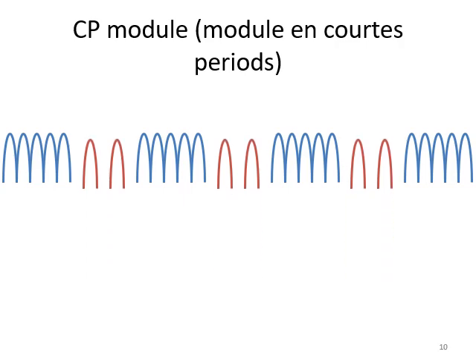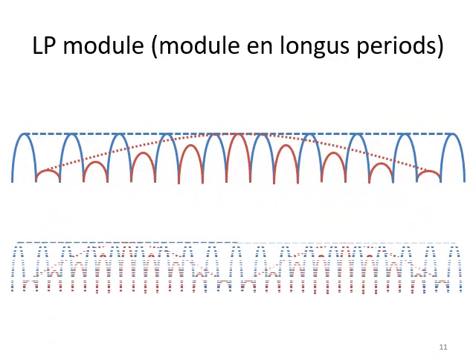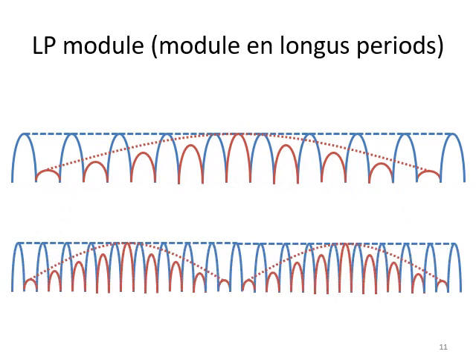The alternate application of MF followed by DF followed by MF followed by DF types of diadynamic currents forms a new format of diadynamic currents, which is known as CP module. Another type of diadynamic currents is LP module, where two MF versions of diadynamic currents are coming subsequently.